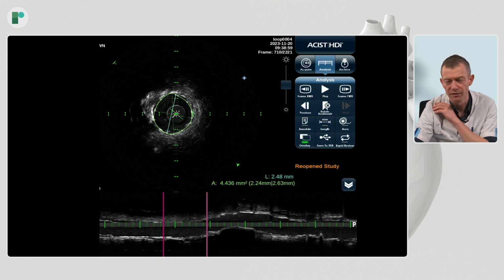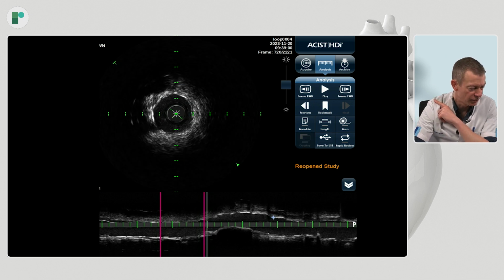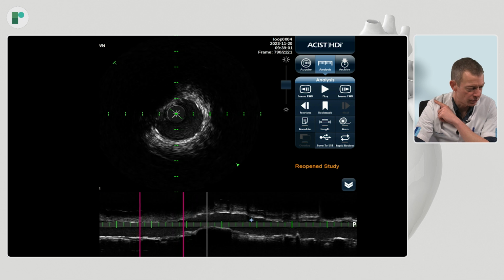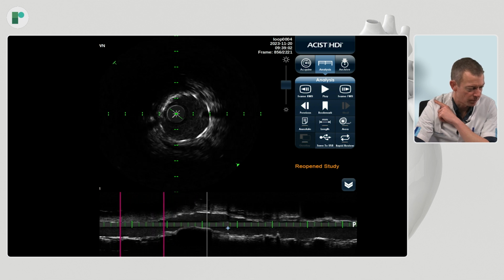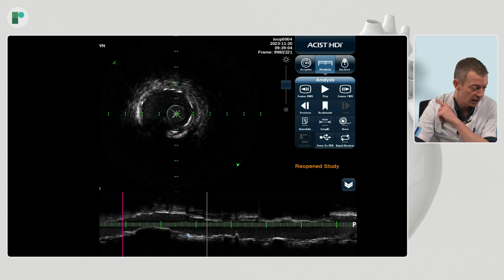This is below 5, and below 5 specifically in a 3.0, 3.5, or 4.0 stent, there's no need to measure more. 4.4 is suboptimal. So with that, we already know what to do, and we can stop further analyzing this pullback, because the next step is more post-dilatation or additional maneuvers to increase the stent area, and then repeat the imaging again.